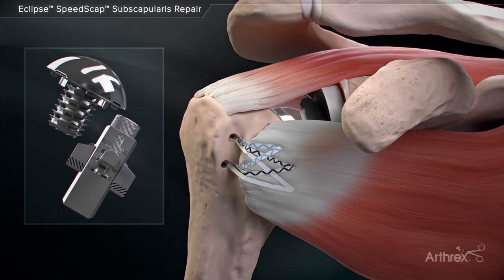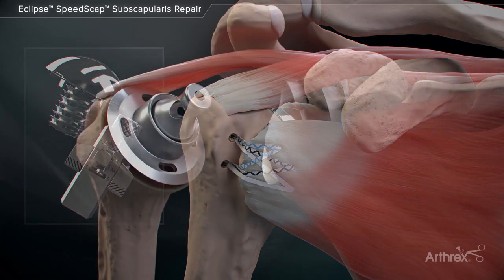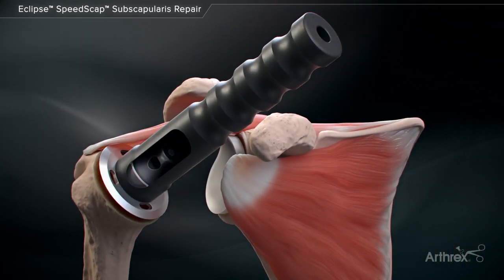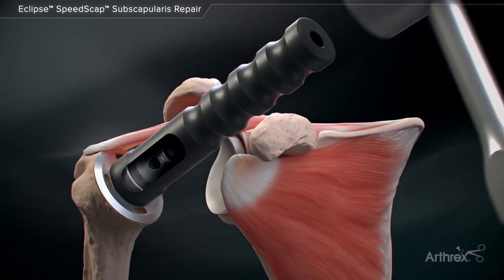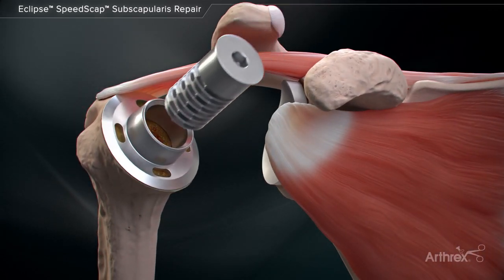After preparation of the humerus, including humeral head osteotomy and trunnion and cage screw sizing, the final trunnion is guided over the centering device and malleted into place. The cage screw is then inserted until the final fixation is achieved.